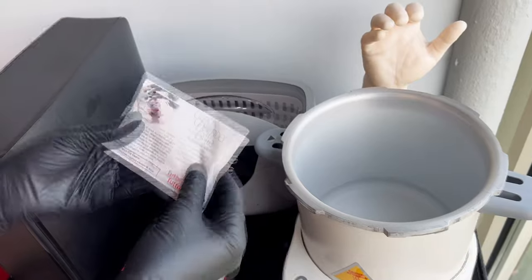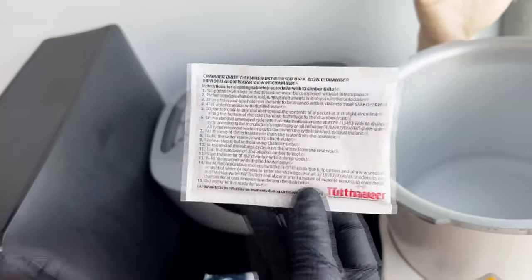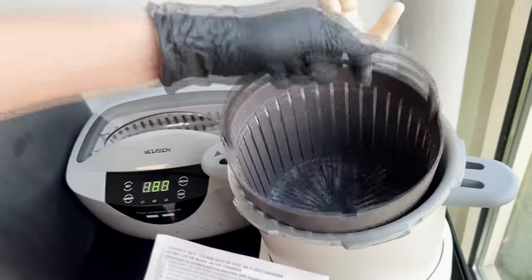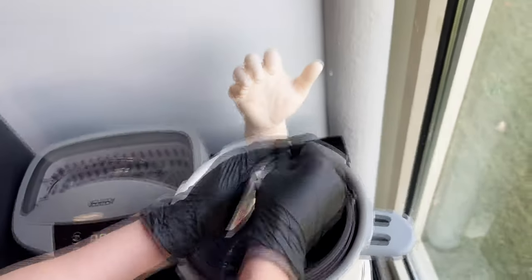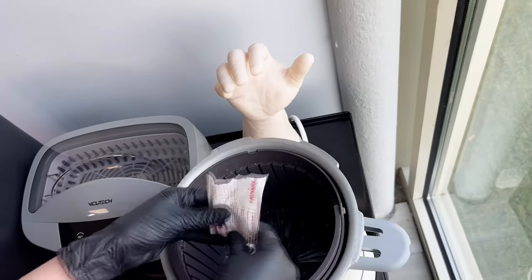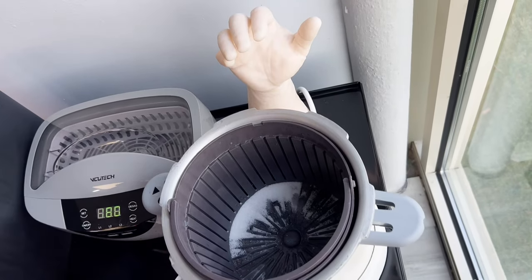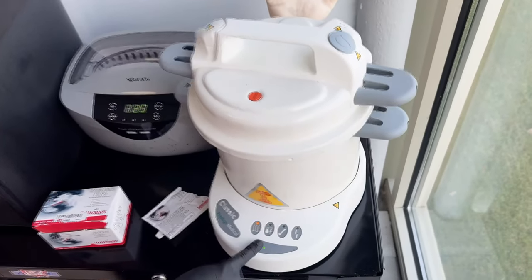They're single packets and the directions are right on the packet. You just put the basket back in, open up the Chamber Bright packet, pour it in, and re-close the top. One more step — start it. One hour later, the cycle is complete and it's been cleaned.